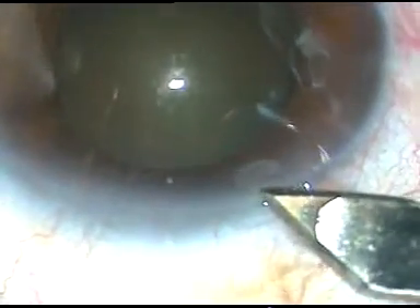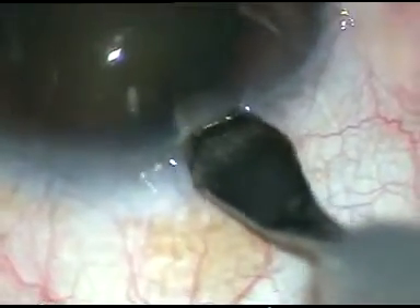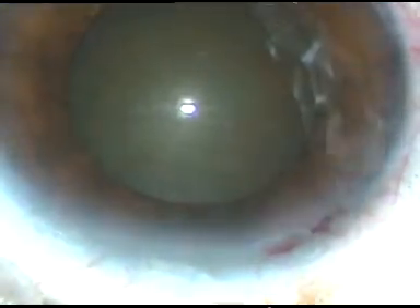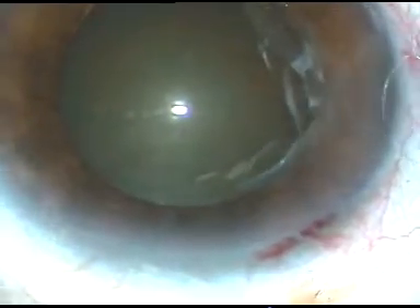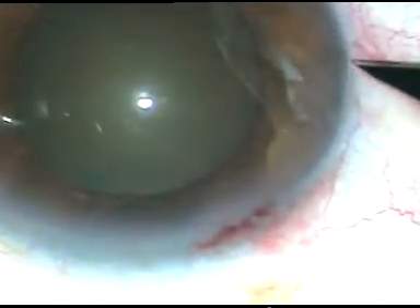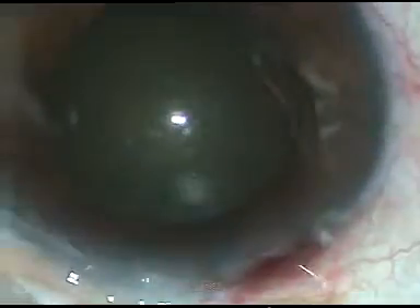Dear colleagues, this video shows the way out when the pupil becomes small while chopping the nucleus. You can see this is a cataract with grade 3 nuclear sclerosis. The pupil has dilated quite well, say up to 6.5 mm or so. And if the pupil remains like this throughout the surgery, there should not be any problem.